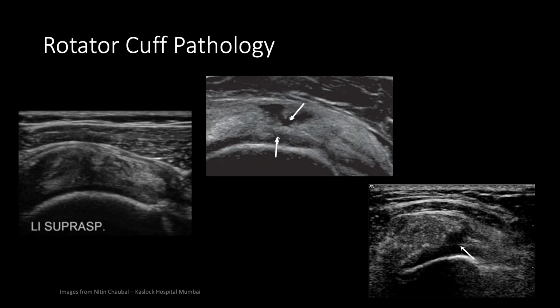Despite having lots of moving parts, the basis for ultrasound-supported diagnosis of a rotator cuff injury is identical to that of other tendons around the body, such as the biceps tendon that we looked at a few minutes ago. The challenge here is remembering how you visualize each tendon individually, which takes a mastery of the anatomy and diligent practice with your exam technique. We'll practice this together in POCUS Clinic, our MSK ultrasound workshops, and you'll practice this when you rotate with Dr. Neisler in MSK Clinic.